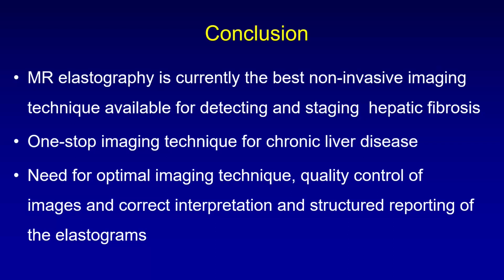Obviously, there is a need for an optimal imaging technique and high quality control of images. As I discussed, we need to ensure that the elastograms generated are of diagnostic quality and not low diagnostic quality or non-diagnostic. You need to have correct interpretation of the images, and we need to evolve a structured reporting pattern for these elastograms to make MRE viable and reproducible.